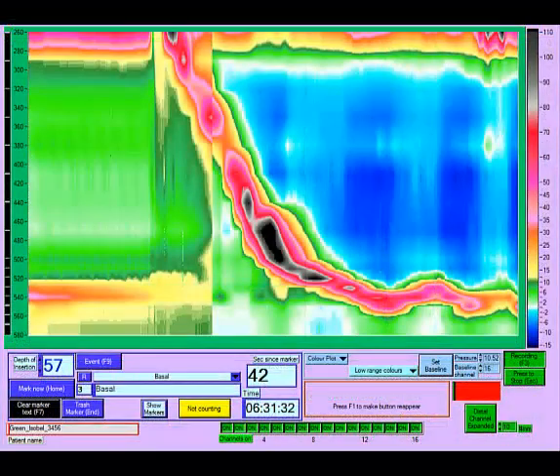The next step is to position the catheter in the patient, with the upper sphincter at the top of the colour plot and the lower sphincter in the high resolution zone of the catheter at the bottom of the plot. Pass the catheter through the nose into the stomach to about 50 centimetres and secure it at that point.